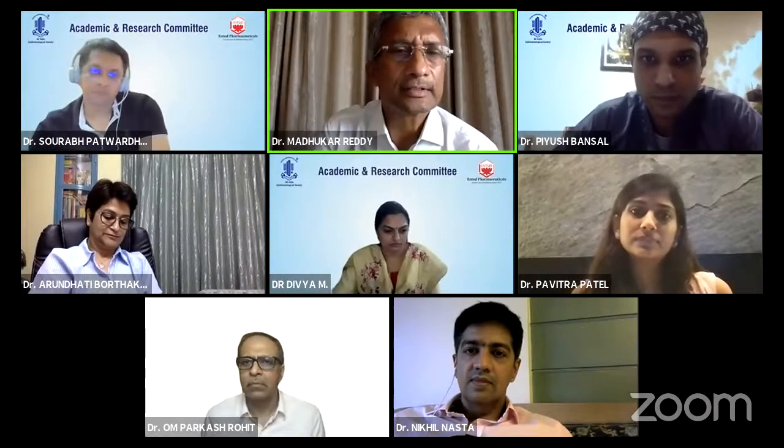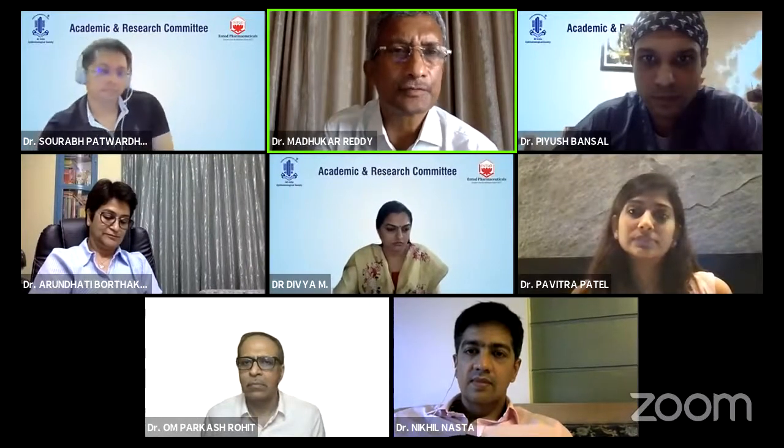Yeah, I think it was managed very well, and that was the right thing to do. And Rohit commented on most of the issues.